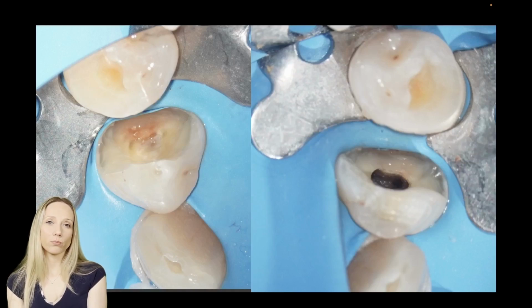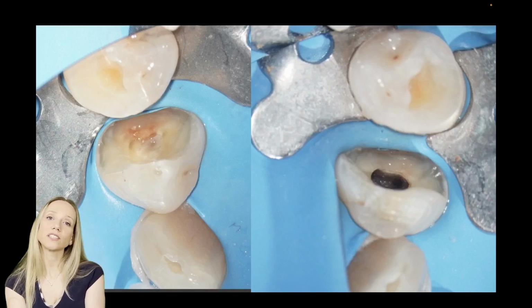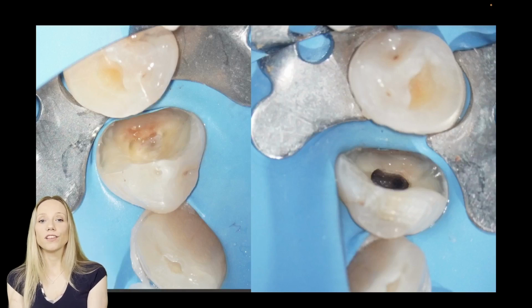And the pulp chamber floor is telling it clearly, because I have one line that guides me once I have found one root canal opening toward the second one. And if we remember the Krasner and Rankow symmetry law, that's symmetric. I found one root canal opening and on the other side another root canal opening. So I will have to deal with the lower premolar with two root canals.